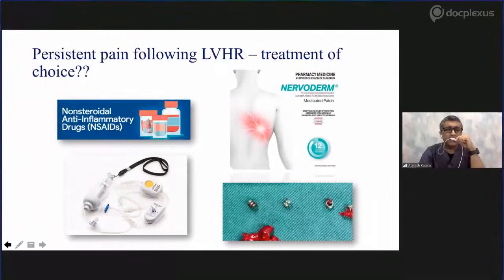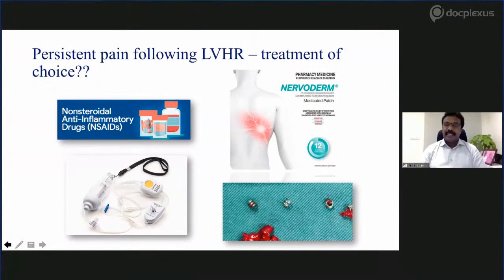Now, if I may add one more thing, Shiva, sorry. It is important to reduce the pressure of the pneumoperitoneum before actually measuring your size, because a tense abdomen may give you a wrong reading. Okay. Shiva, may I comment?